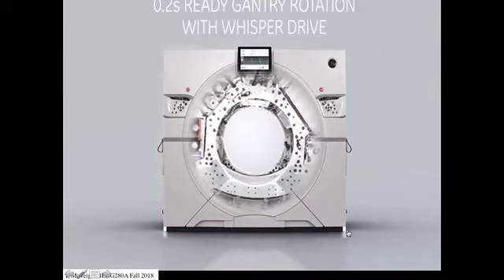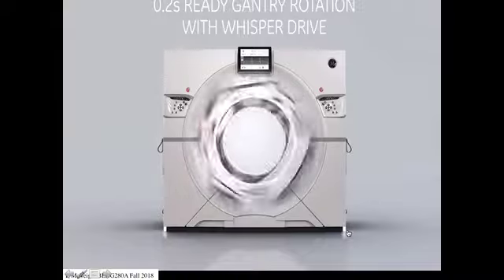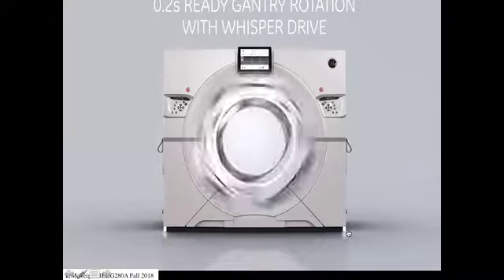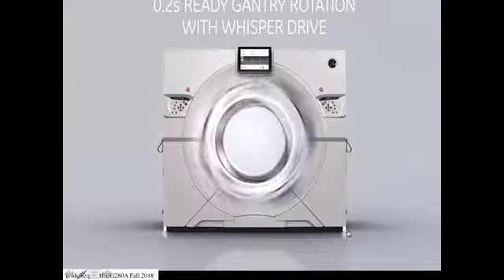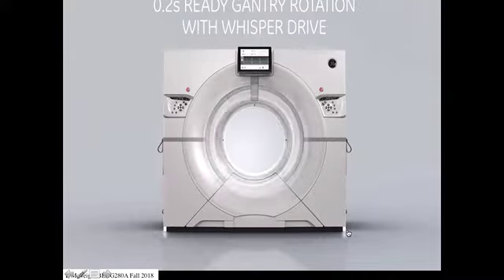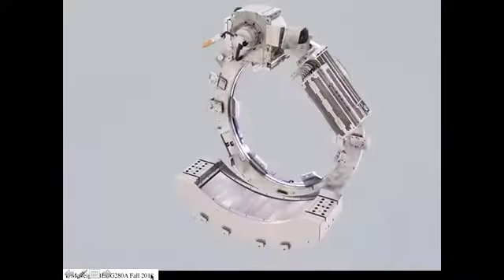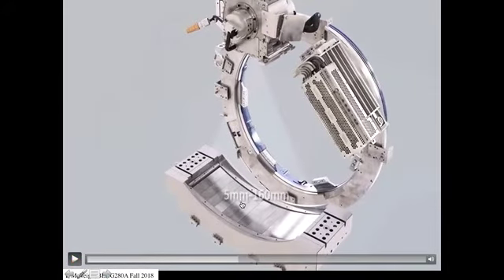So here's a little movie of a modern, this is a GE Revolution CT. They just take a video of the thing spinning, spins up to about that speed. It's covered so the patient doesn't see that happening, right? Because it's a little disconcerting when you're in there. And so here is the detector. Okay, this is the X-ray source up here, and this is the detector.